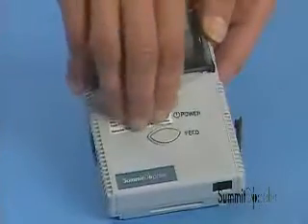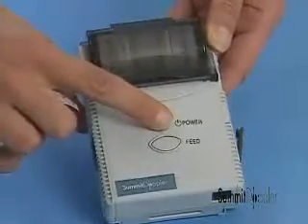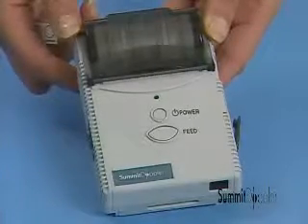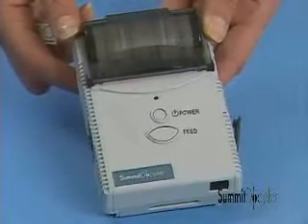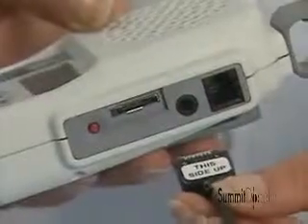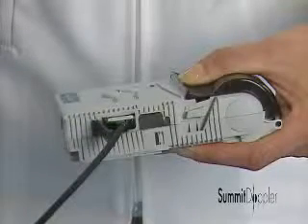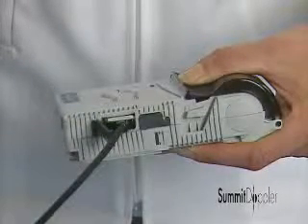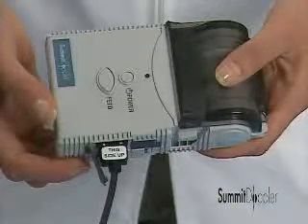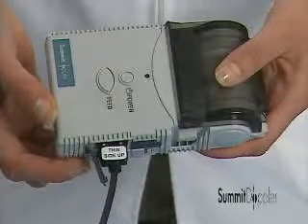The LifeDop 250 ABI printer is supplied with paper already loaded. To turn on the printer, press and hold the printer on-off button for 3 seconds. The printer LED will flash green when the power is on. The printer cable plugs into the side of the Doppler unit and into the side of the printer. Both ends of the cable are the same, and the cable is labeled to show which side of the connector is up. Press the lever gently to unplug the cable.